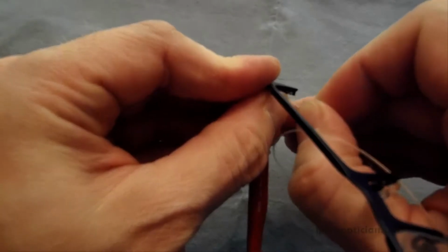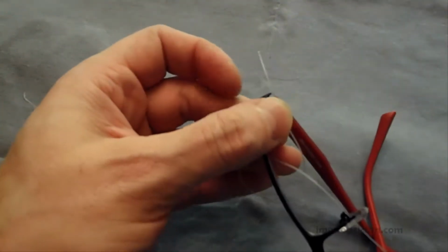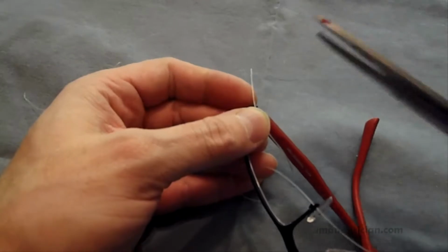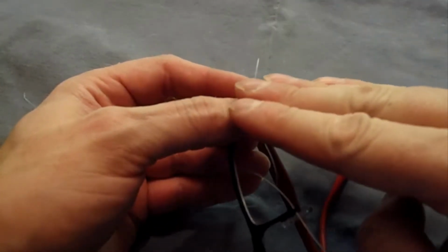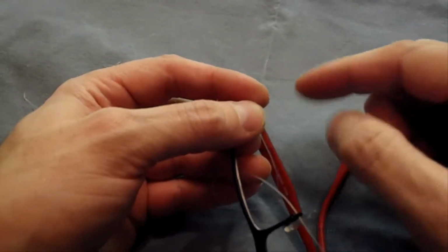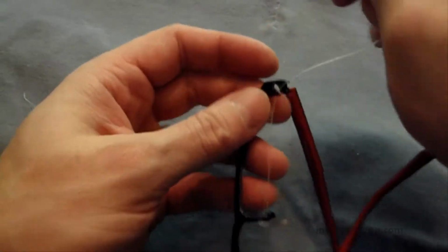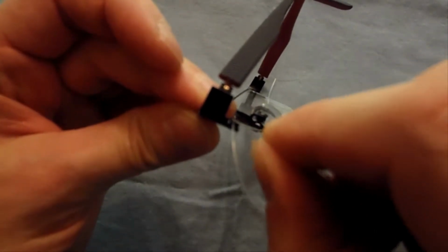Now if you're having trouble getting it through the hole, keep in mind when you're cutting the string, you don't want to use a clipper, because a clipper will actually crimp that end, and it'll be tough to get out. You want to use a pair of scissors to snip it, and it will slice it into a nice end. Or you can use a knife, like an X-Acto blade, and cut it at an angle, and you'll get a real pointy end. It'll go in and out of those holes really easy. So pull that through nice so you've got enough to work with, and then we're going to go again back to the inside through the top hole.